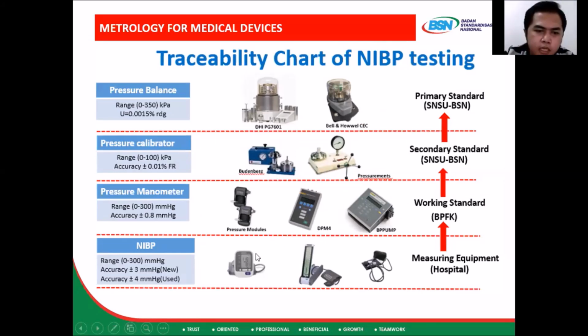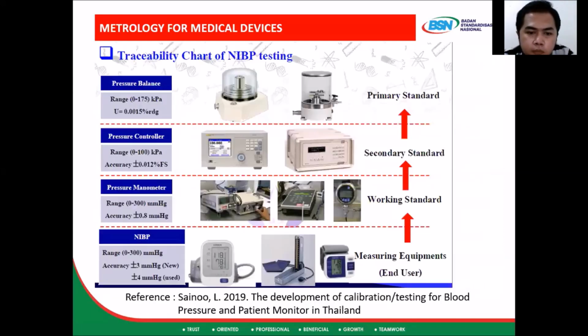However, on the automated NIBP device, this is difficult because when we press the start button, the pressure increases and then deflates. It is different from the manual one.